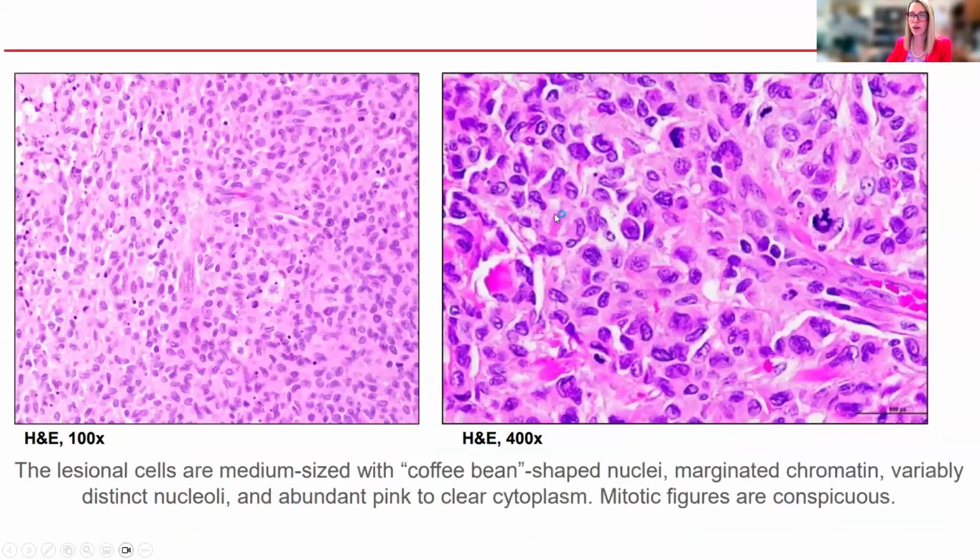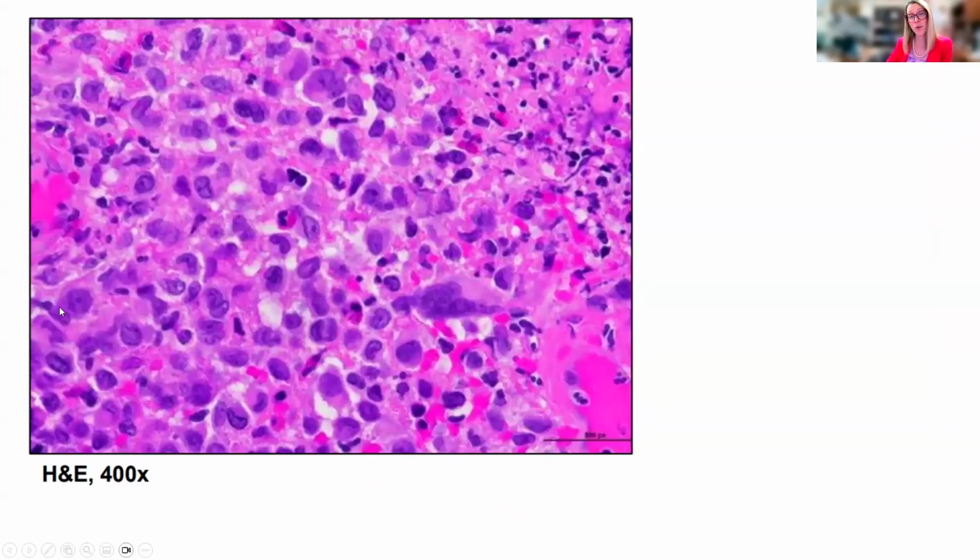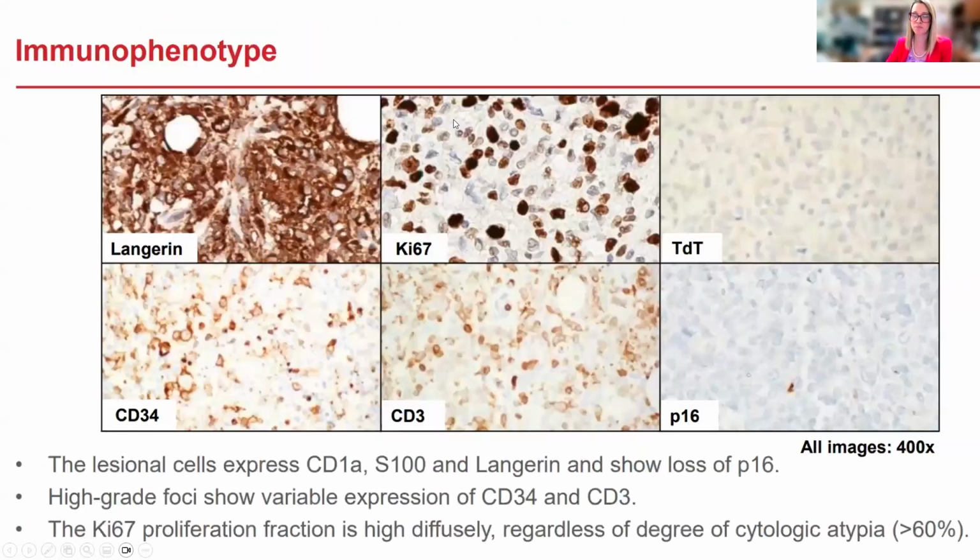And as you scanned around in some of the different areas with the sheet-like infiltrate, the cells were starting to look a little atypical, getting a little bit larger, a little more hyperchromatic, somewhat losing that nice reniform typical appearance, with mitoses that are getting a little on the atypical side. And then there were areas within the same lesion of more frank malignant anaplastic appearance with necrosis.